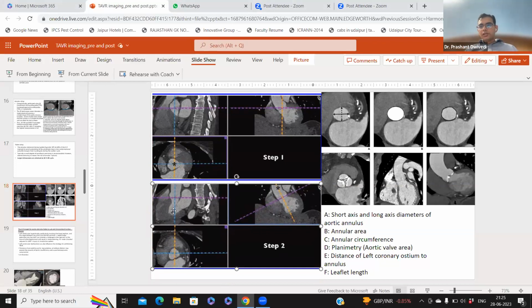Yes. So aortic root angle is basically an angle between the aorta and the LV. If the aortic root angle is more than 60 degrees, it's considered a horizontal aorta. Whenever it's a horizontal aorta, it will be slightly difficult to negotiate the valve and slightly difficult to position the valve. So here we need a relatively more stiff wire to position the valve and everything. So how to get this horizontal aorta angle? We usually measure it in the 3mensio. I might need to share the screen again for this.